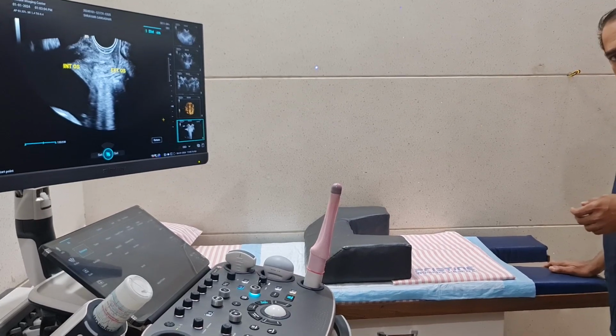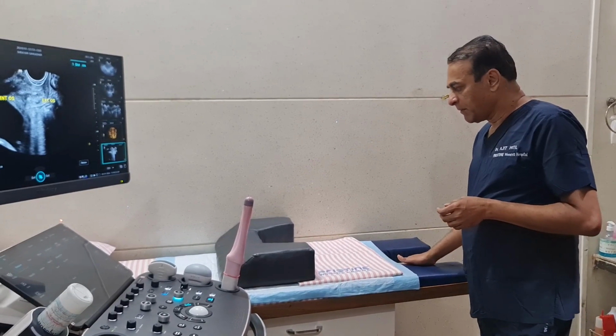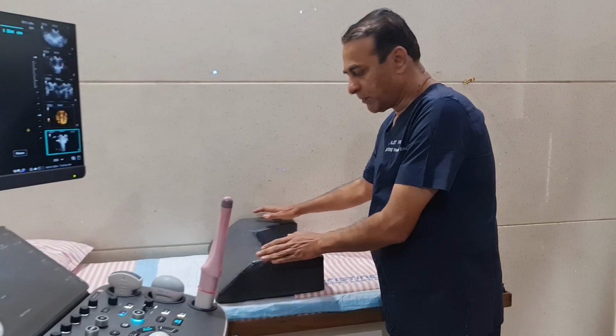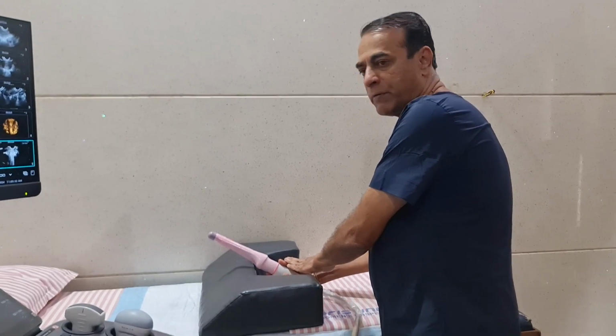Take the patients to the edge of the table, and if the table has got a lithotomy curve like this, it will be very easy. If it is not there, then you can design a pillow like this, which can be kept under the patient's buttocks so that the probe can be maneuvered, the probe can be moved quite comfortably.